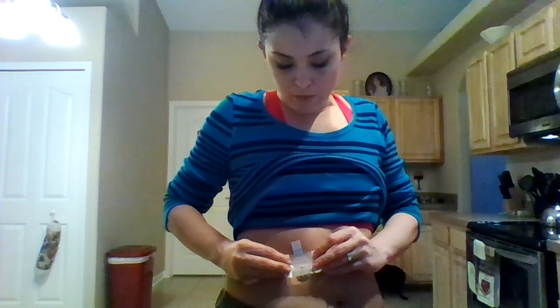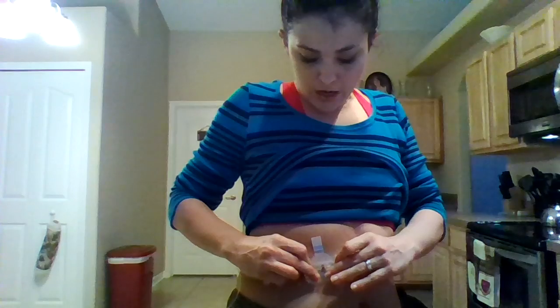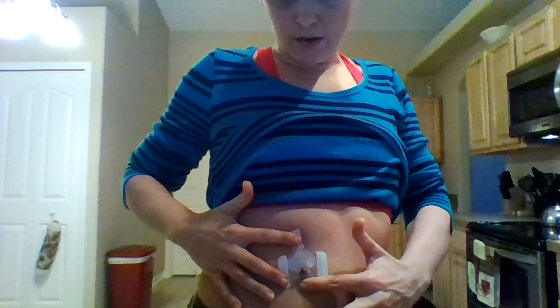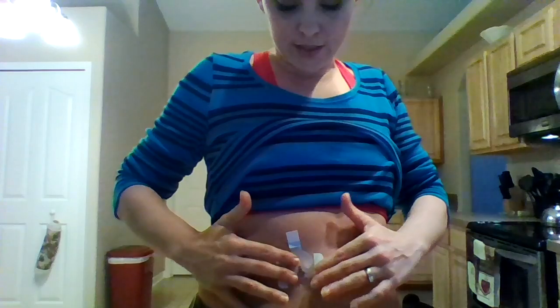All right, so when you go to put this on, your goal is to have the sensor in the middle of that hole. There's a hole, and you want the sensor in the middle of it, but you want this bottom piece to be half on your skin and half on the sensor. So now you're holding the sensor in place with that. I don't know if you can tell, but right here is the top of the tape, and right here is the bottom. And actually, I probably should have gone down just a tad further, but it'll more than likely hold.